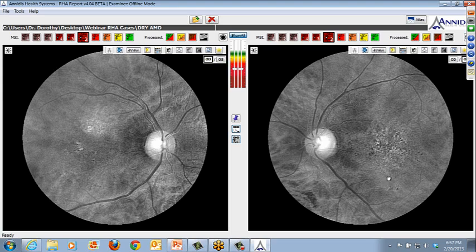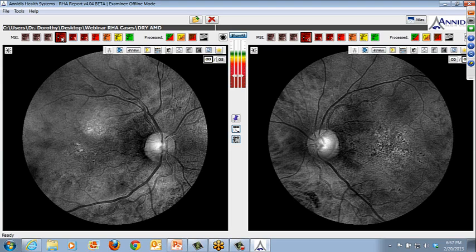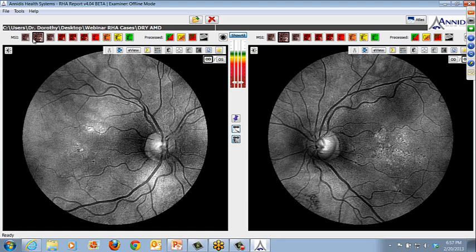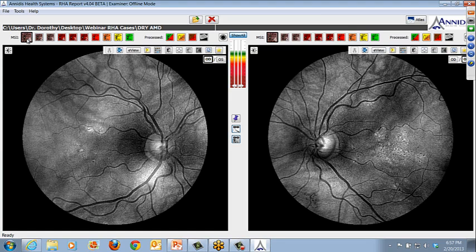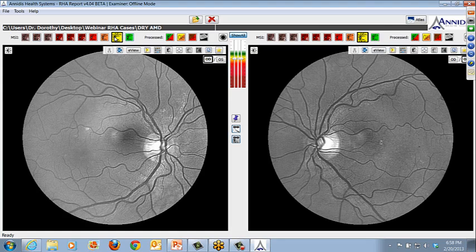Starting in the most anterior portion of the RPE, you can definitely see migration of the RPE or melanin pigment. You can see atrophy indicated by the patchy white areas where you're actually seeing down through past the RPE. And you'll see that most hyper-reflective on your red 3s and your red 4s. And as you get down into the choroid with the infrared images, you'll see that atrophy fade. Of course, this is pretty significant atrophy and should give you a sense of how significant this particular patient's AMD is.